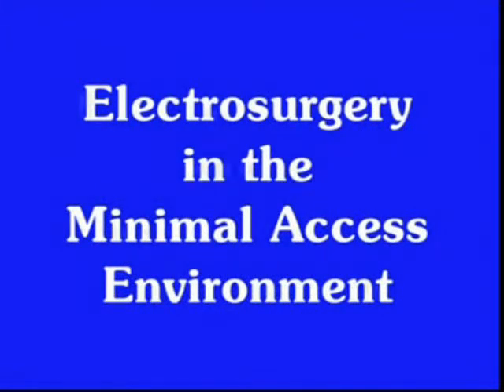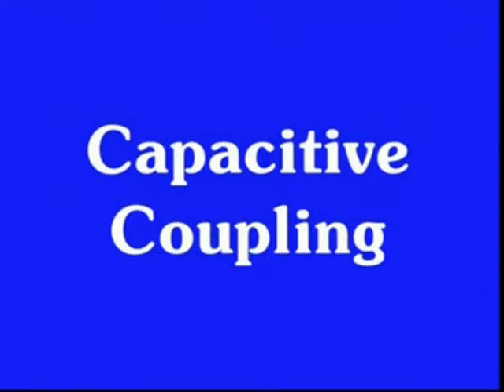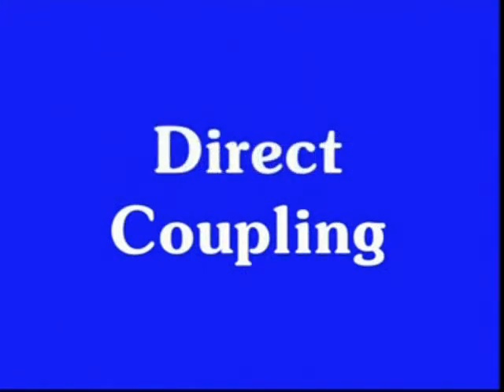When electrosurgery is used in the context of minimal access surgery, it raises a new set of safety concerns: direct coupling, insulation failure, and capacitive coupling. We'll deal firstly with direct coupling.